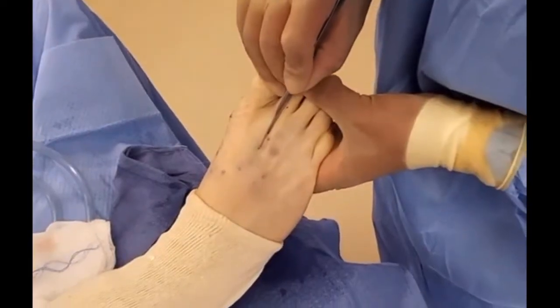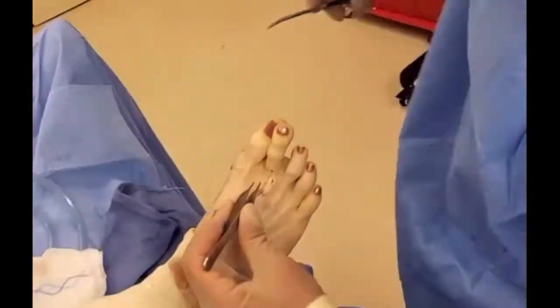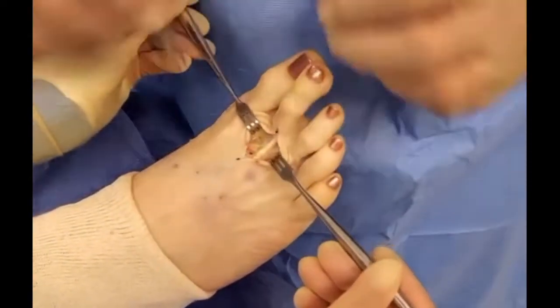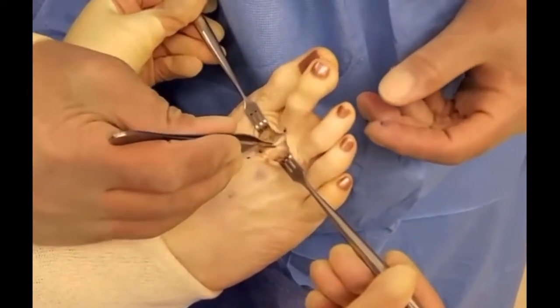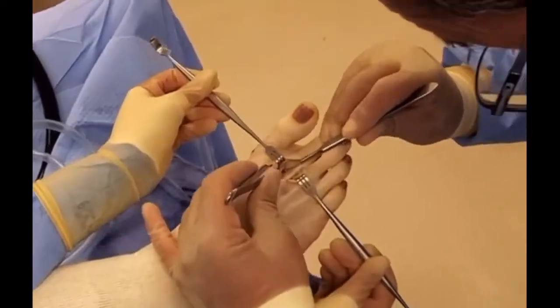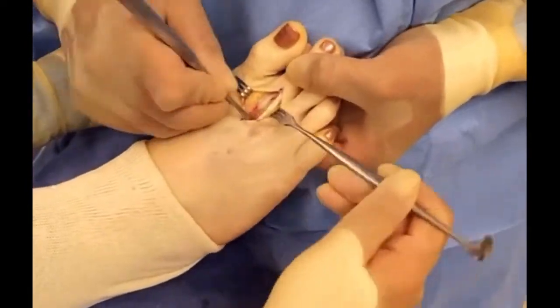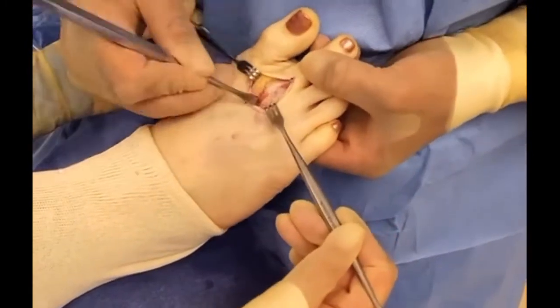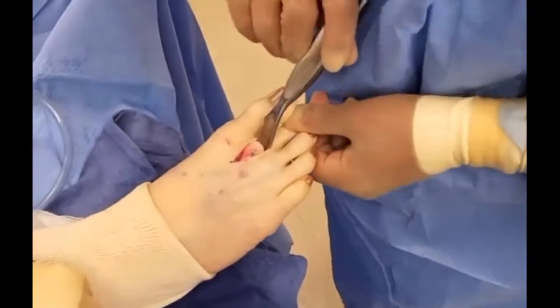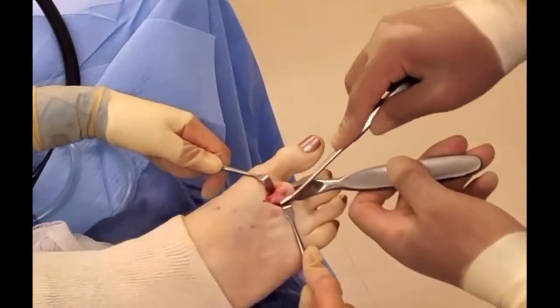We have the extensor tendon here — this is the tendon that pulls the toe up — and as you can see, it's pulling the toe and it's way too tight, so we're going to have to lengthen that. There's the bone, highly irregular. This is how I'd run the cuts right here.